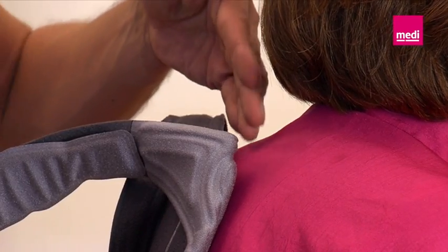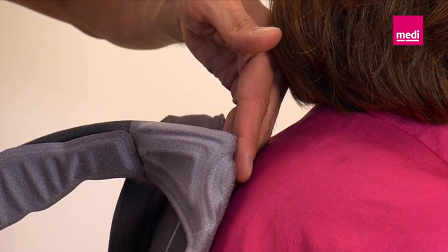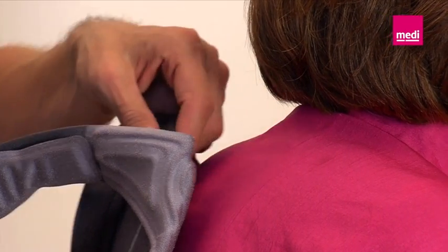To allow the patient to stand up straight with the brace, a small gap with a width of about three fingers should be kept free between the splint and the body at the upper edge of the brace.